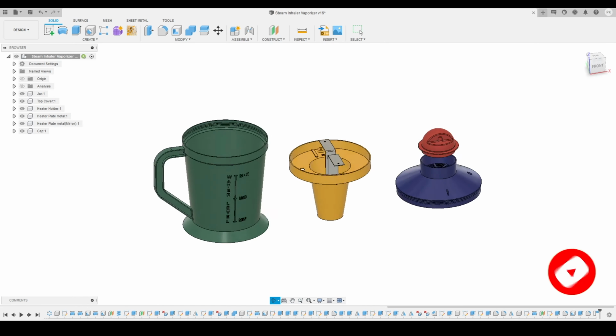So now what I can do, I can go to this insert panel over here. Then I will click on the canvas, and I will click on insert from computer. And here you can see I'm going to use this jar image as a reference image. So I will select that and click on open. Now I have to select the plane on which I want to put my canvas. So I had selected the plane and will press OK to accept the result. So here you can see I had just inserted a canvas inside the jar component.